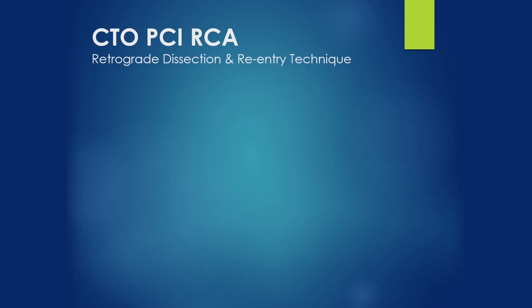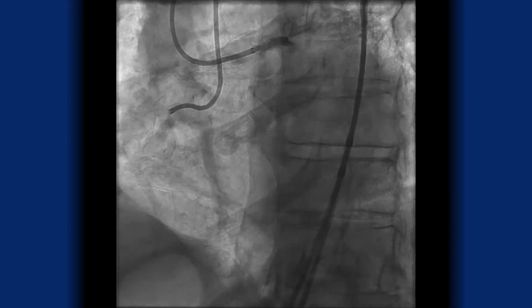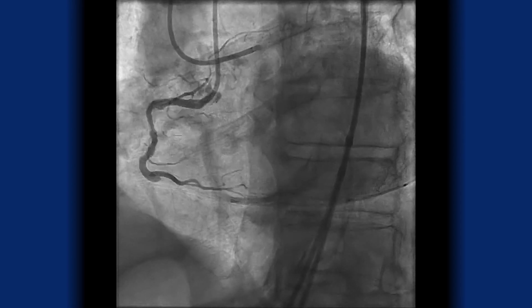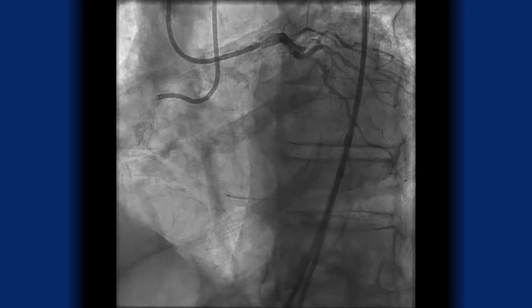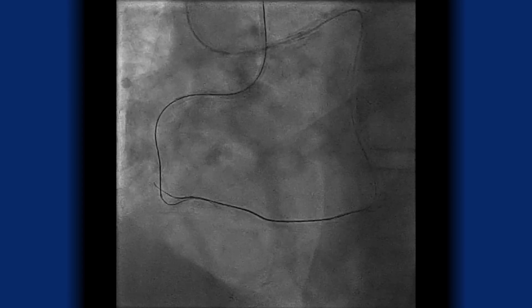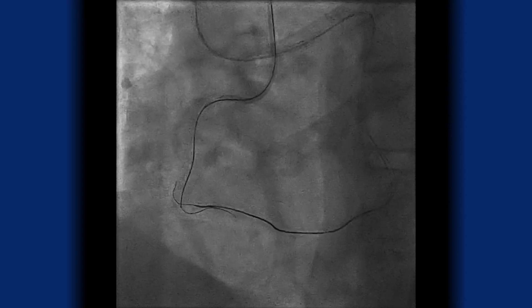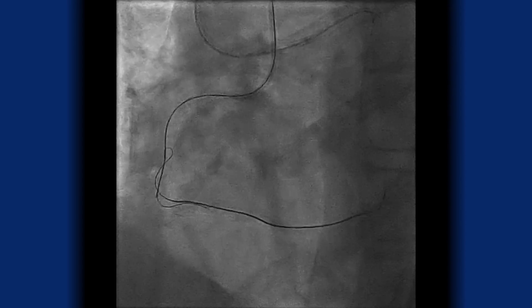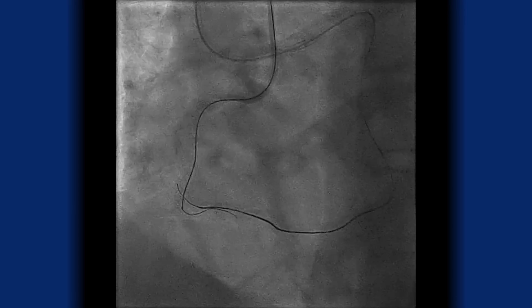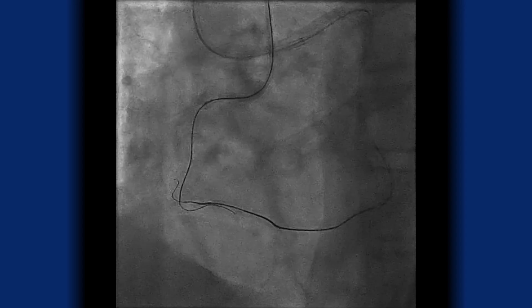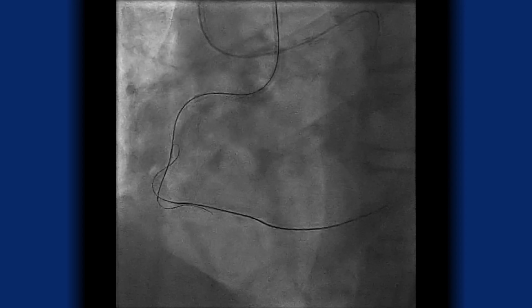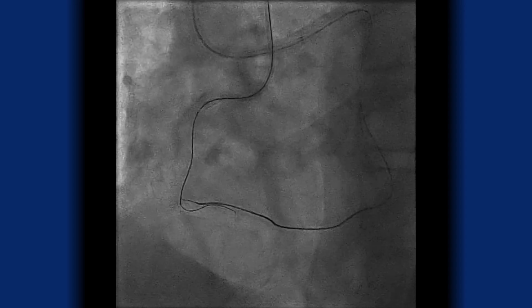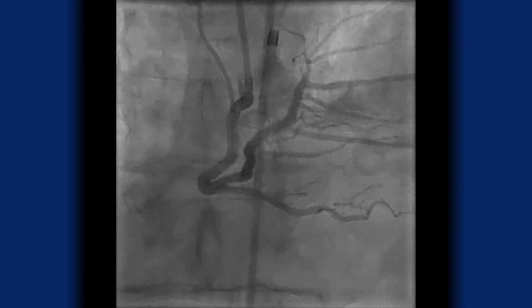This is another example of a right coronary CTO PCI. Here you see an occluded segment of the right coronary artery utilizing dual injection. We have a wire in the right coronary artery in the antegrade fashion, and another wire from the left side going through the septal perforator, engaging the right coronary artery retrograde. Dissection is performed from the retrograde approach and reentry is performed. Thereafter, angioplasty and stent placement is performed, and this is the final result.